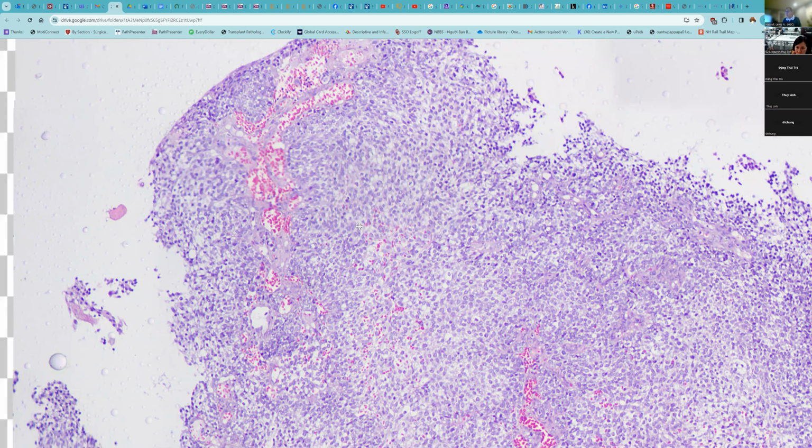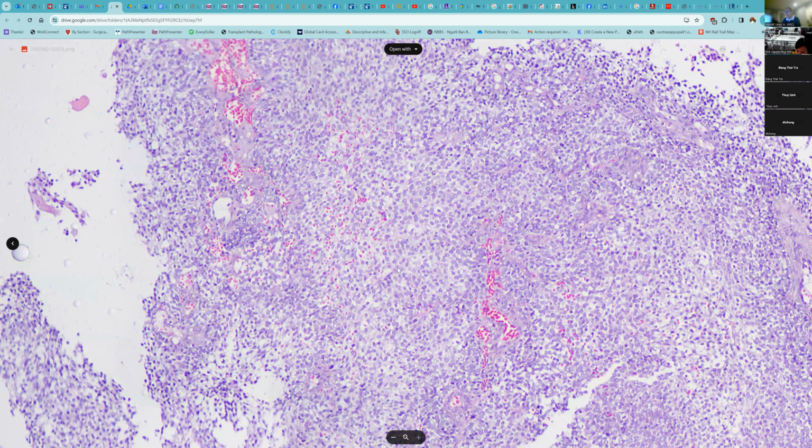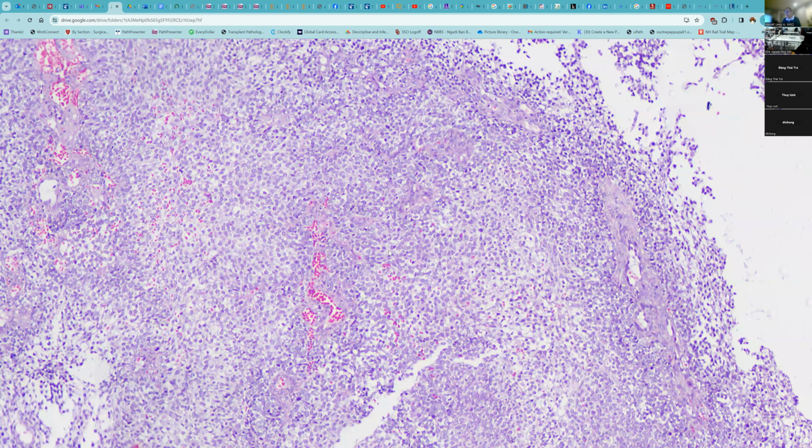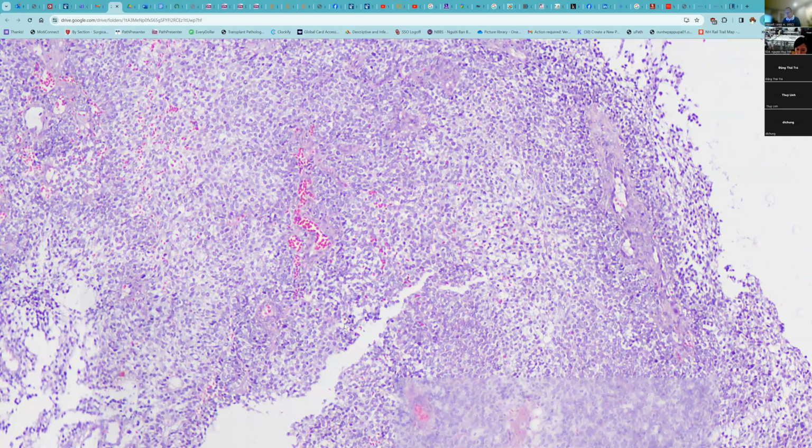And the tumor cells here are quite uniform. Yes, uniform. I don't have a higher magnification, but there's a moderate amount of clear cytoplasm and fairly uniform nuclei. It looks as though they're atypical and would be considered malignant based on the pattern of cells.